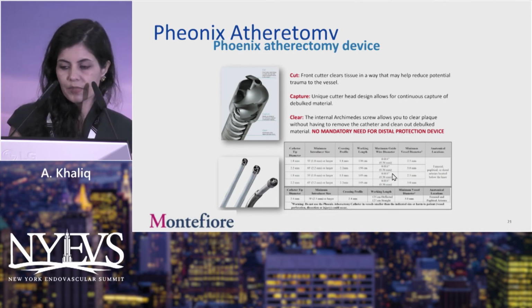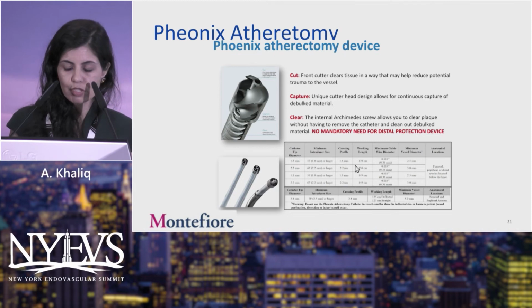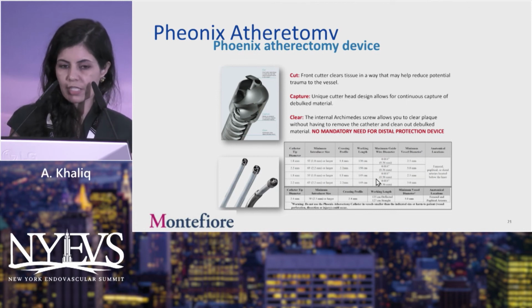And again, it's 014 compatible. Most of these are 6 French compatible devices, except the 2.4 one, which is a 7 French compatible device. The other difference with the 2.4 device is that it has a deflectable tip. Therefore, it kind of overlaps with the directional atherectomy system.